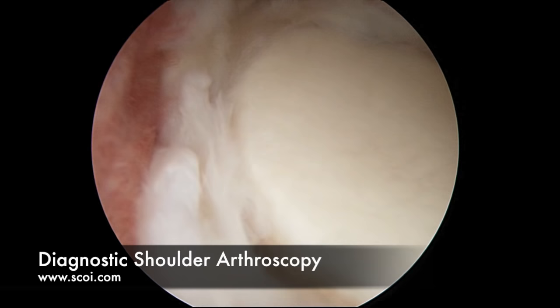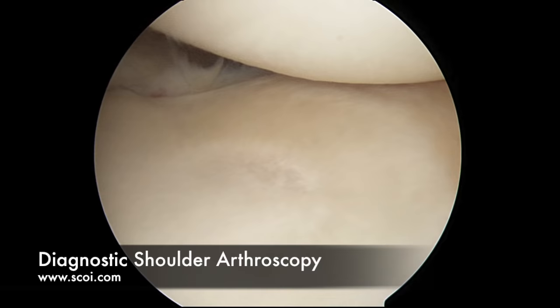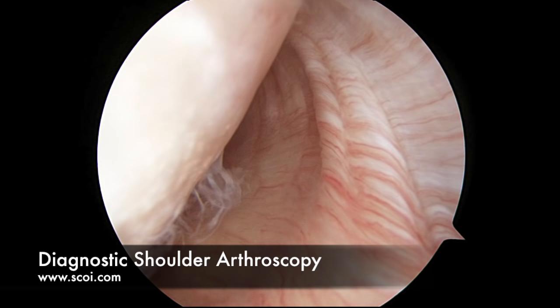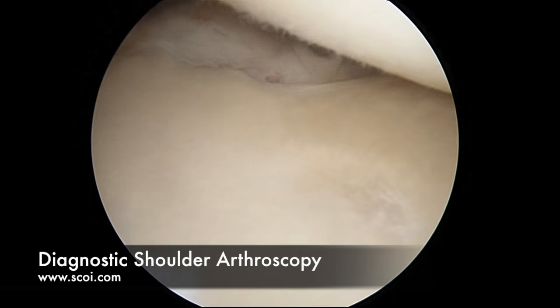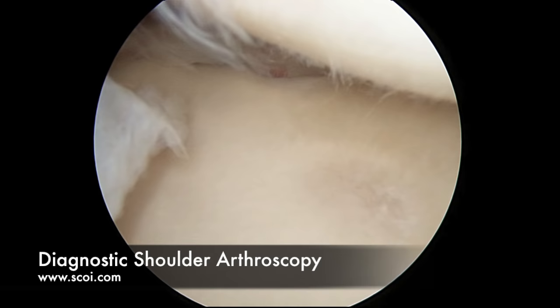We'll come around the posterior aspect of the labrum and look at its connection to the glenoid — that looks quite good. As people get older, the labrum can degenerate and get a bit torn. Inferiorly, that is the inferior glenohumeral ligaments near the armpit — those can be torn as well, but they're intact in this case. We'll look down and inspect the glenoid itself for signs of cartilage damage, arthritis, or bone loss. This glenoid is well maintained, no signs of significant arthritis.